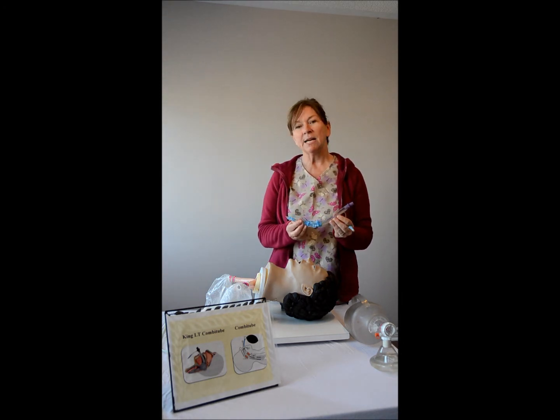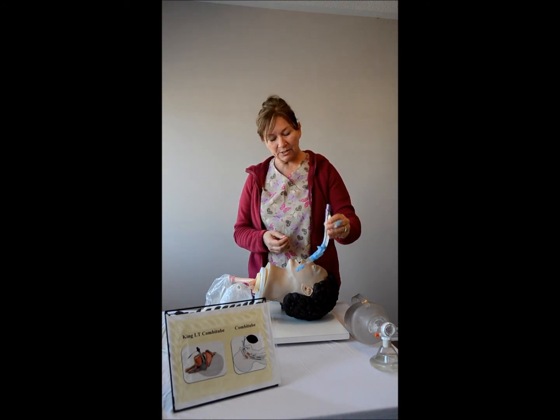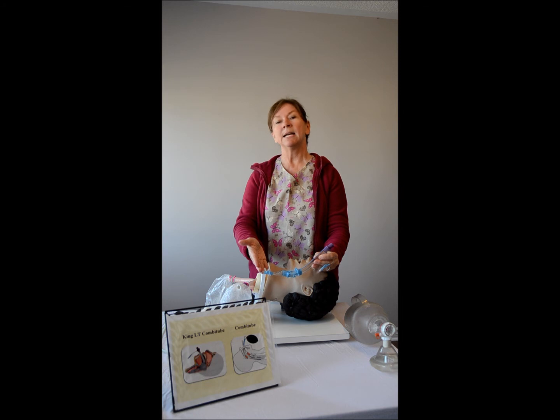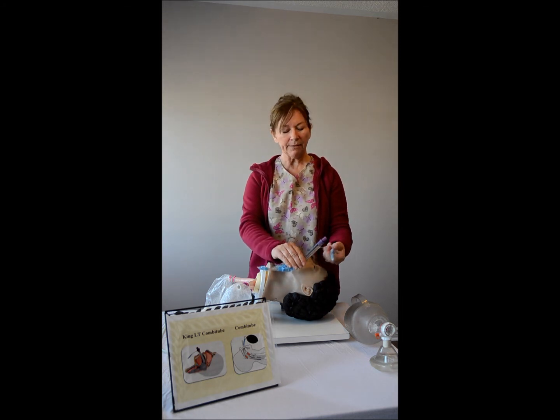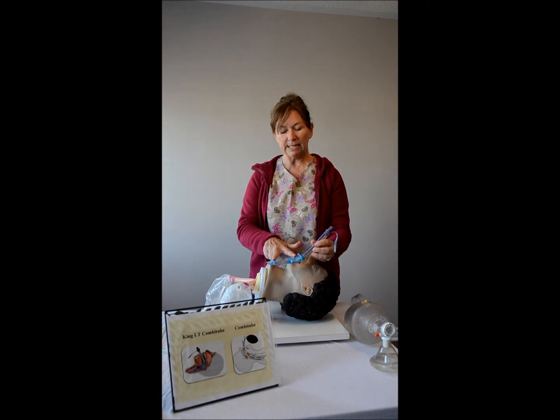The tubes are sized based on the patient's height. You insert the tube and it is designed so that the tip enters into the esophagus. The cuff is then inflated, and by doing so you will see that both balloons become distended.